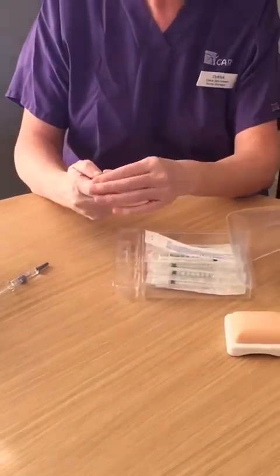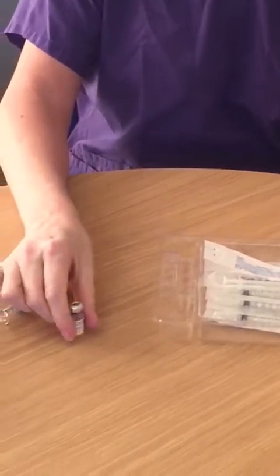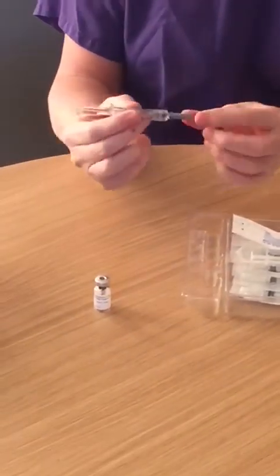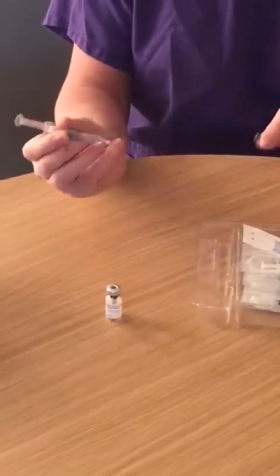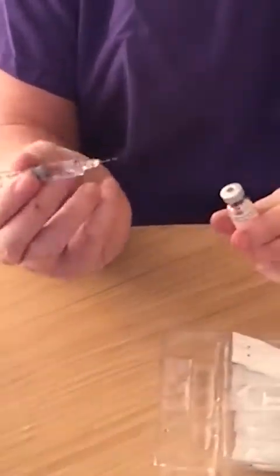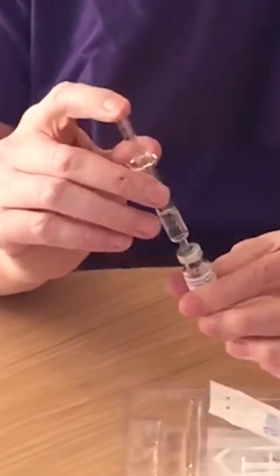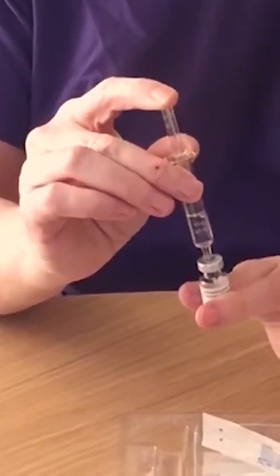Remove the cap from the lid of the powder with your thumb and remove the cover of the needle on the solvent. Place the needle through the middle of the rubber bung and inject the solvent into the vial.